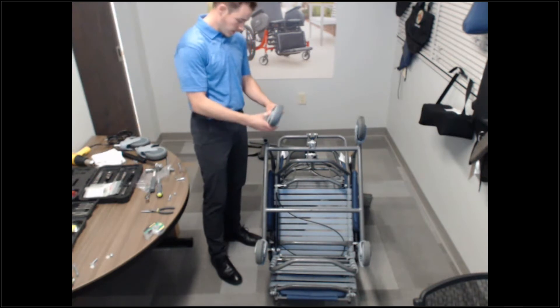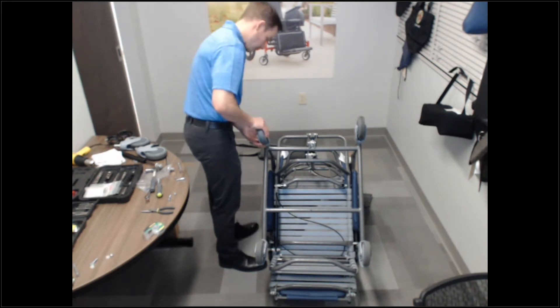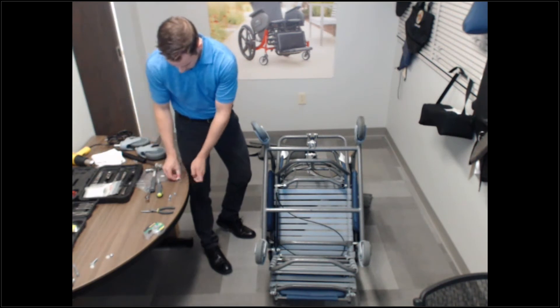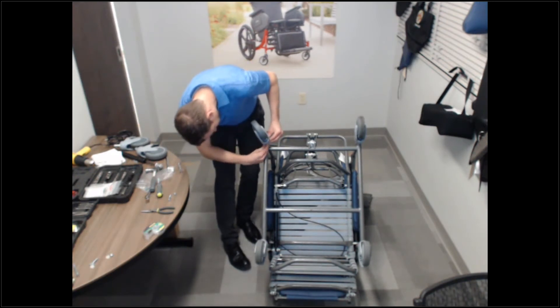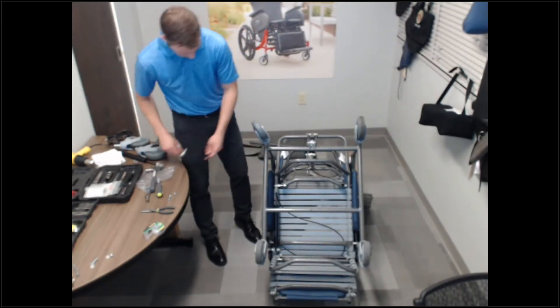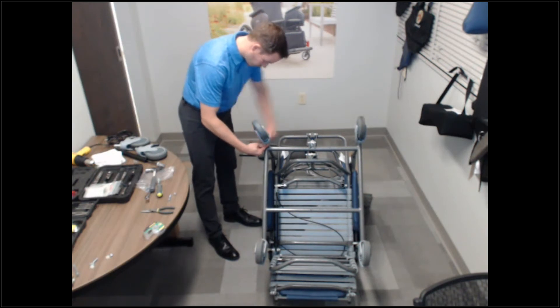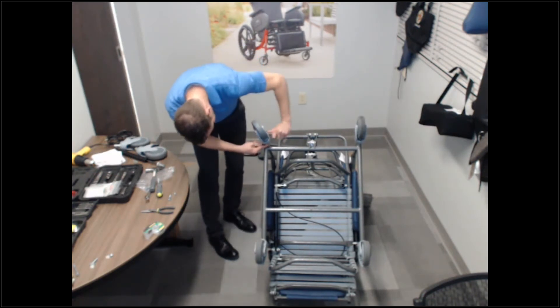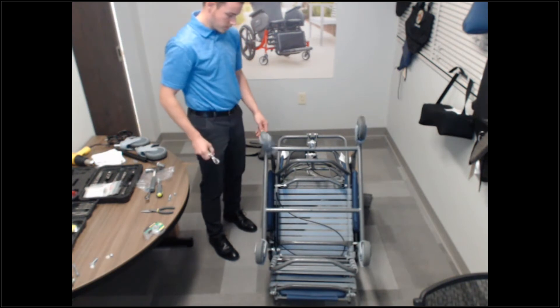The left side is a caster 5-inch TL — total locking caster. It helps to lock the caster into place so you can line up the holes. So we're going to take a look at the holes. That's my swivel caster.